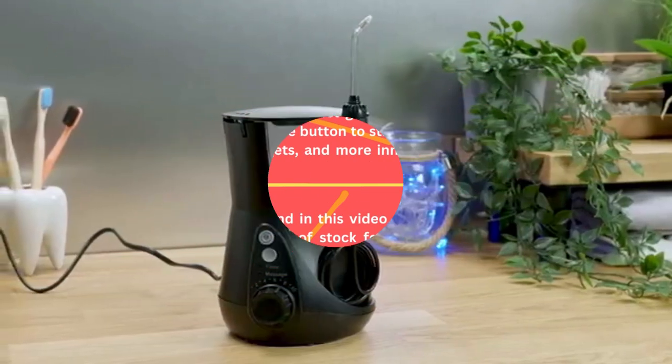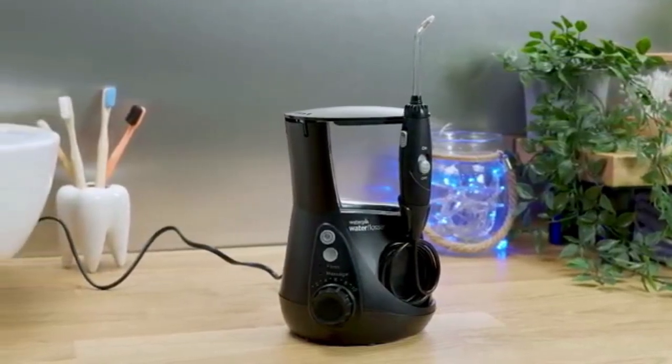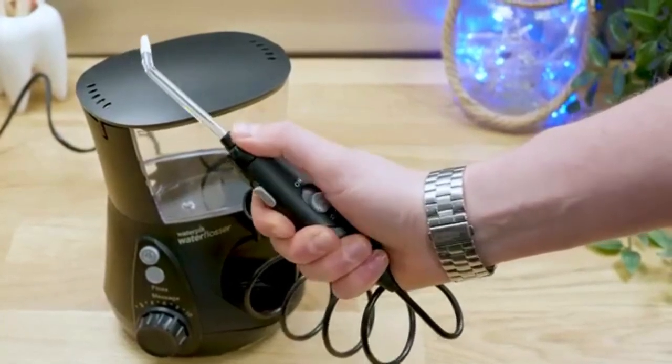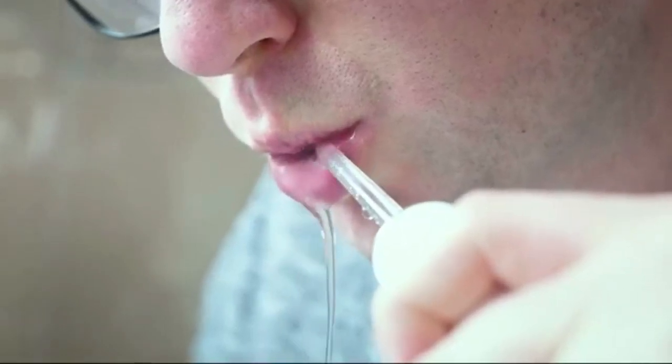When I am asked what countertop water flosser should I buy, the Waterpik Aquarius is my go-to recommendation. It serves so many different users' needs really well. You get a great box contents, good performance and reliability, all for a fair price.